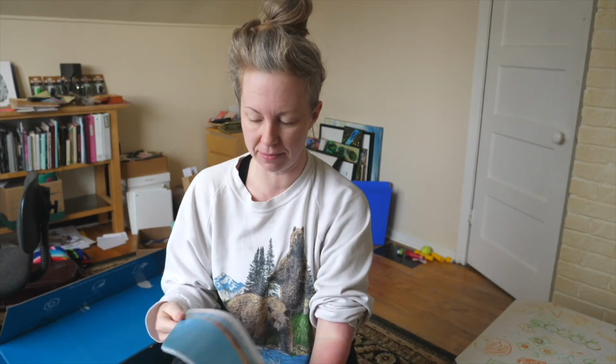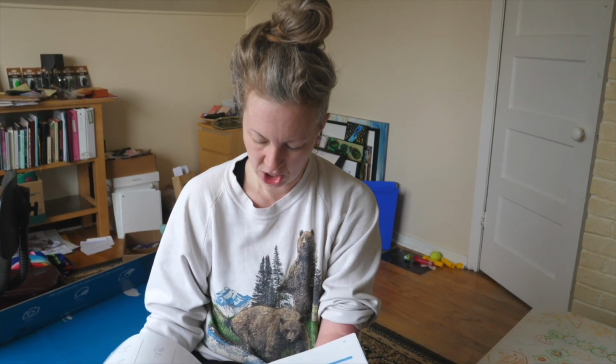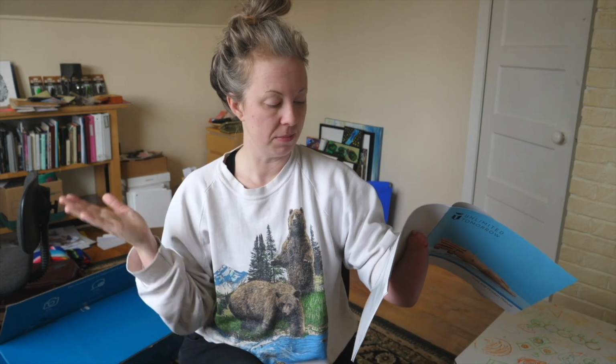And I've already read it. It's a really easy read. I'm actually only on page 11, which is the muscle training page. Oh my gosh, there's so many. So basically what you do is you go to my.unlimitedtomorrow.com/calibration and then you sync up your limb via Bluetooth and they can sense what your muscles are doing.